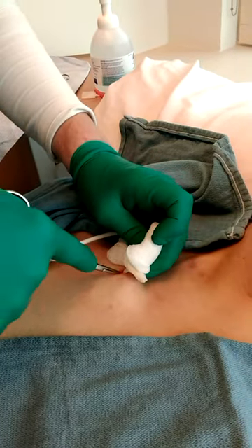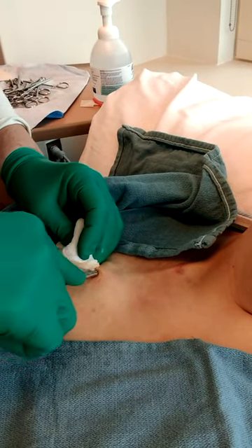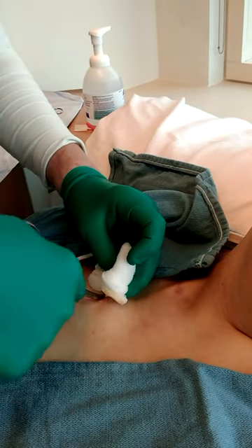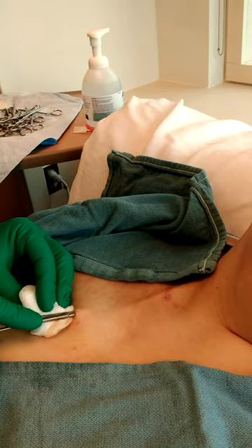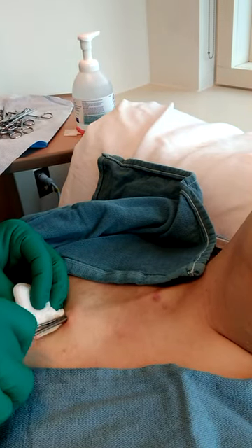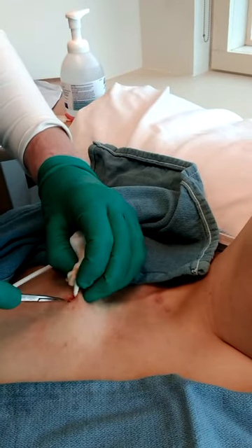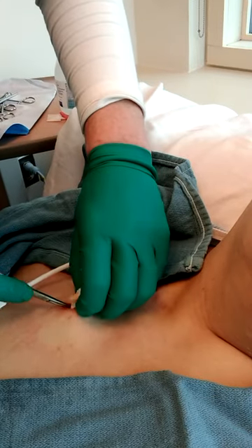Is that the cuff there? It's coming. I can sort of see a little bit of it. I can see the entrance of it — it's about two or three centimeters, probably two centimeters long. You're a tough little guy. We don't yank it, we can't yank it. So there's a cuff right here. The pull tube is made out of this, but the cuff is exactly like a piece of belt.